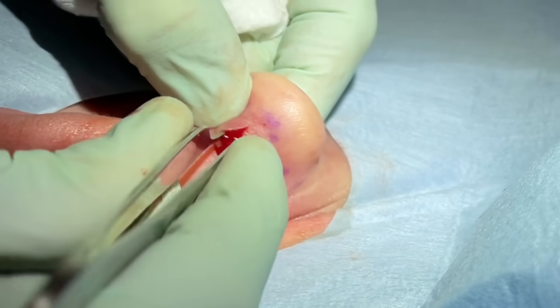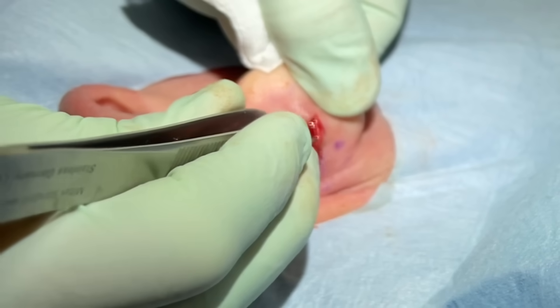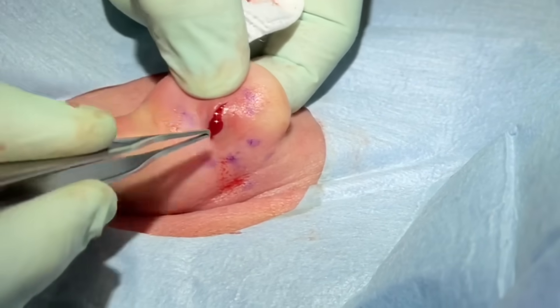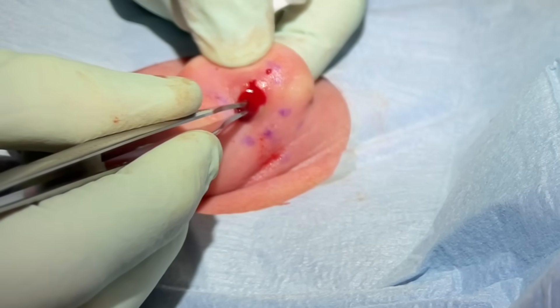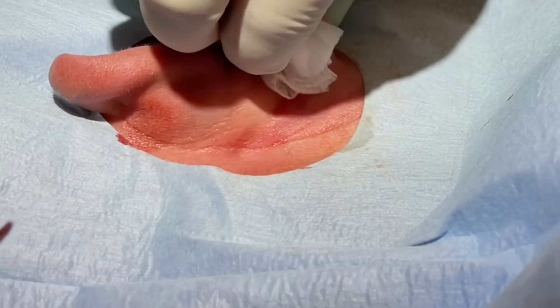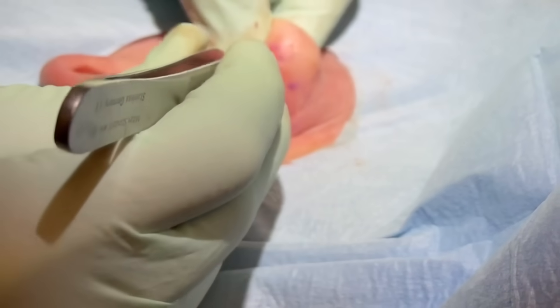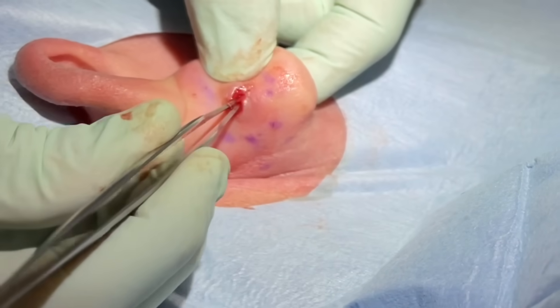We're going to see if we can get some cysts. If there's any pain let me know. There's a little pocket that goes down this way actually. There's cyst contents but they're kind of gelatinous, almost like jelly. No pain there? Good. Perfect. Got you nice and numb. There's some cysts right there. Now you can see it just falls apart so easily.